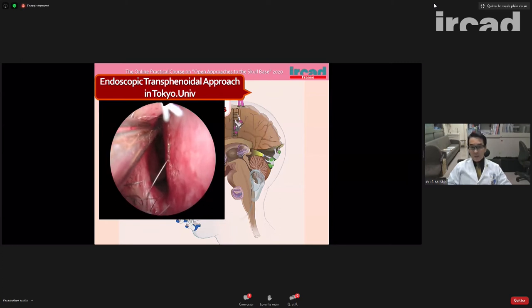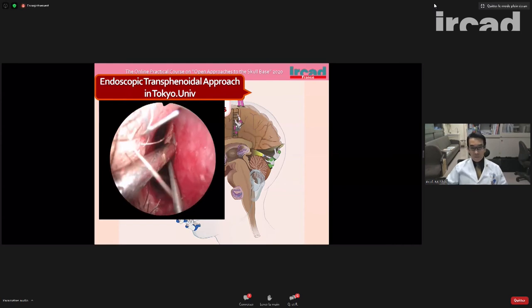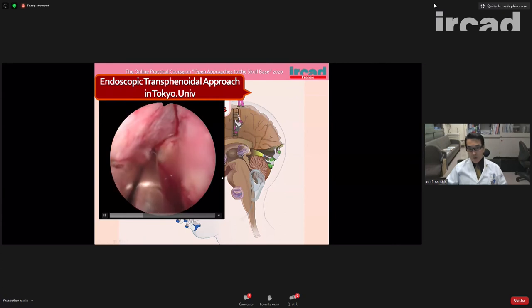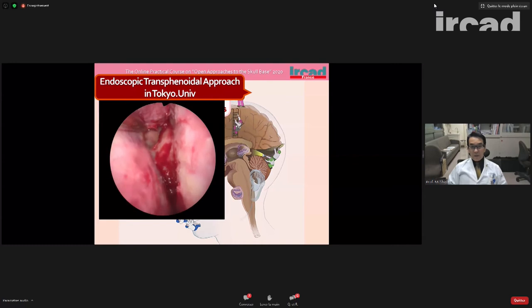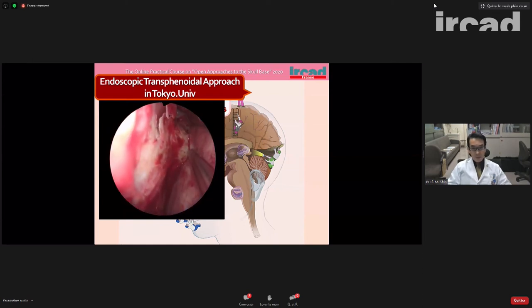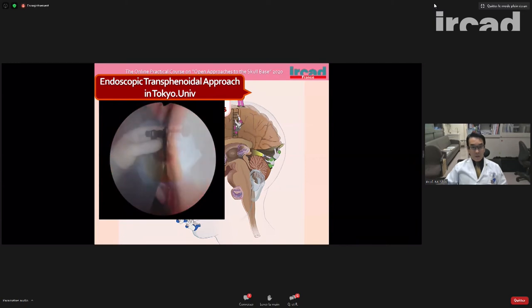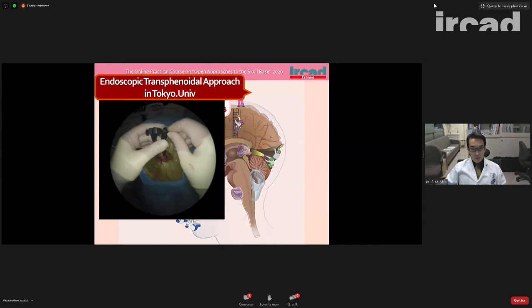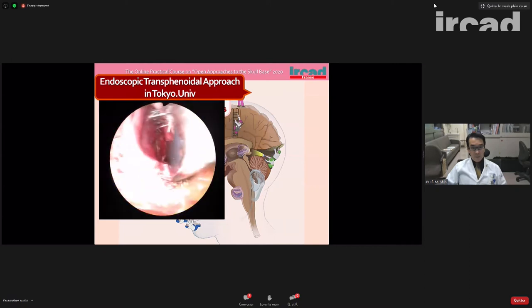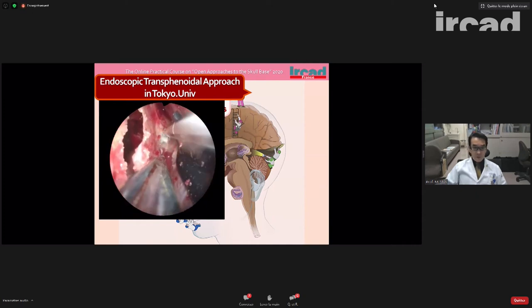We go inside the septal mucosa here and dissect submucosally like this. We put only a small incision on the septal mucosa and then dissect it to the bone. On the other side we make the same incision and dissect the mucosa to the bone, and then the septal bone is temporarily removed and we put the nasal speculum like this, each speculum blade inserted in each nostril. And like this, we can keep a wide surgical field without sacrifice of the nasal turbinate and nasal septum.